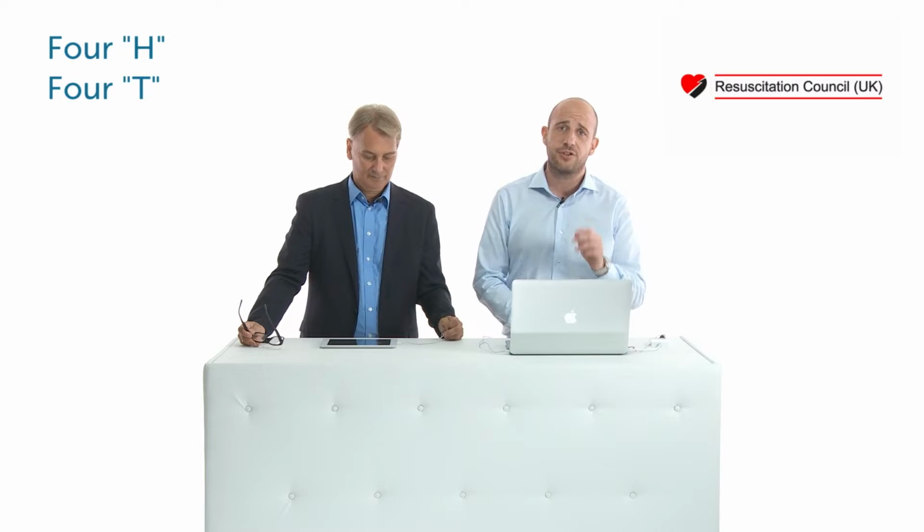Welcome back. In the first part, you learned how to image patients in critical situations. Now we'll show you some causes for critical situations. According to the UK Resuscitation Council guidelines, the reversible causes of cardiac arrest are the 4H and the 4Ts.